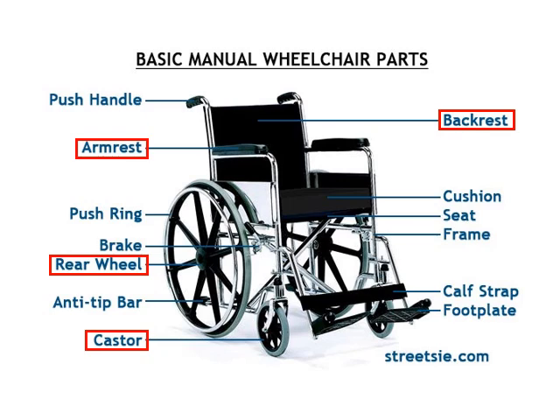There's attachments and extra things that can be added to the wheelchair. So, for example, a person may need a seat belt. The seat belt typically goes across the hips, not the waist. So it goes across the hips at a 45-degree angle to help keep the person seated with a neutral pelvis in the correct position.